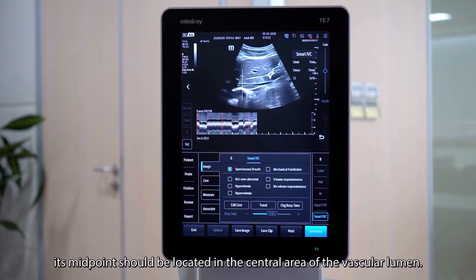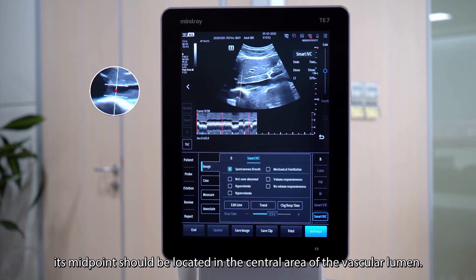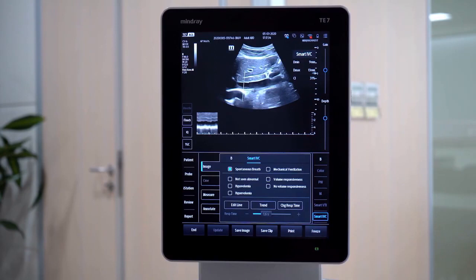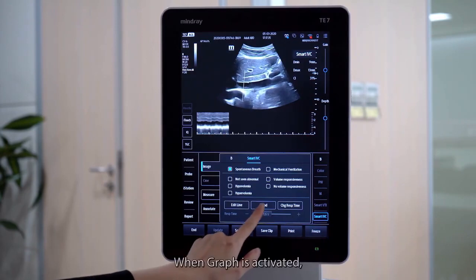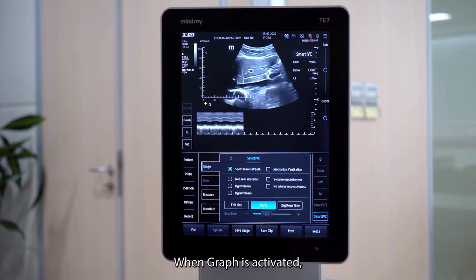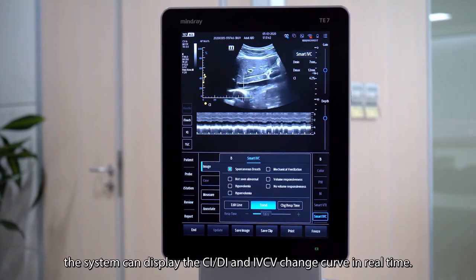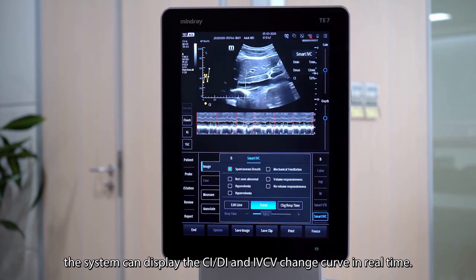In addition, its midpoint should be located in the central area of the vascular lumen. When graph is activated, the system can display the CI, DI, and IVCV change curve in real-time.